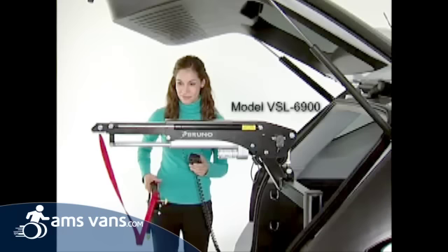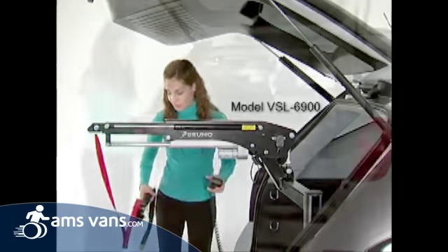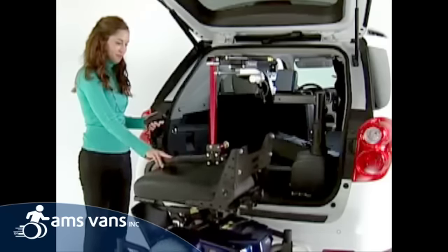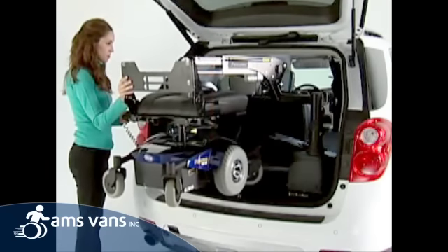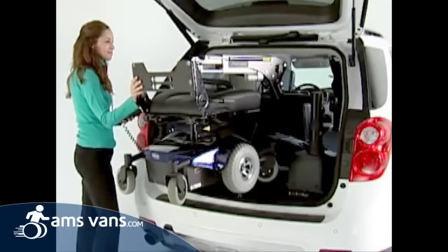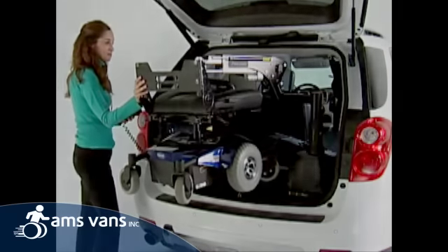The powered telescoping lift head on the model VSL 6900 allows even a large power chair to clear the rear bumper. Once you've passed the bumper, push the retract button and the telescoping arm powers your mobility device closer to the lift for easy rotation into the vehicle.